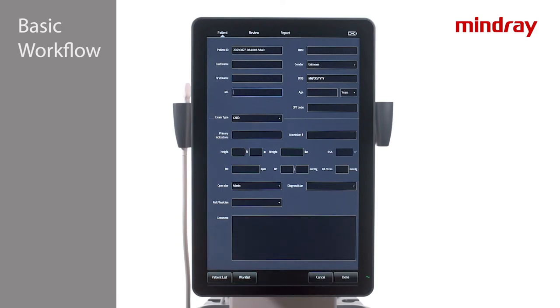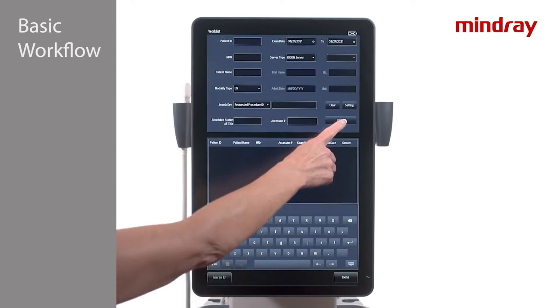If purchased, a barcode scanner can be used to scan a patient's wristband, or a DICOM worklist can be queried. Both of these options will be set up by an applications specialist upon installation of the system. To query a worklist, simply tap the Worklist tab along the bottom of the patient data screen.